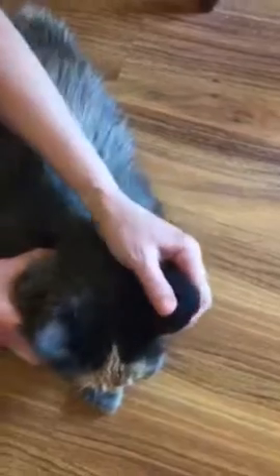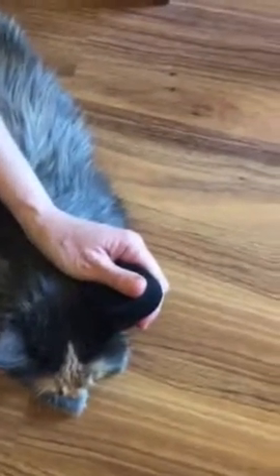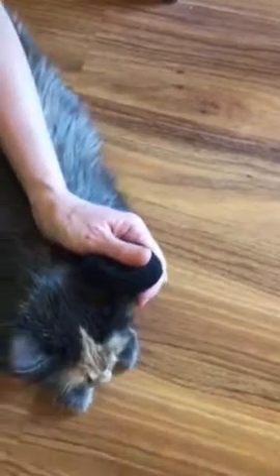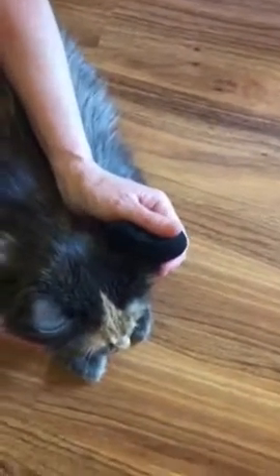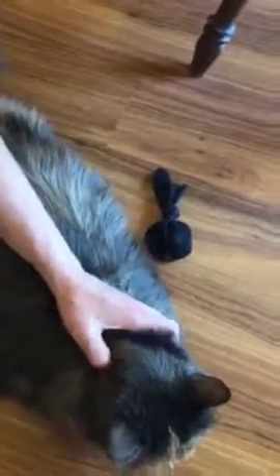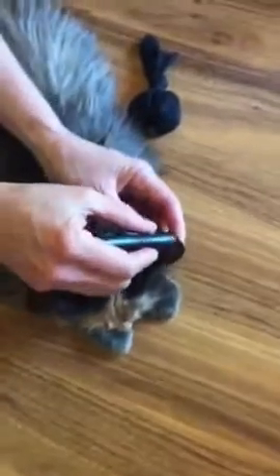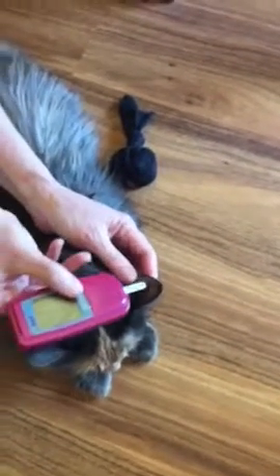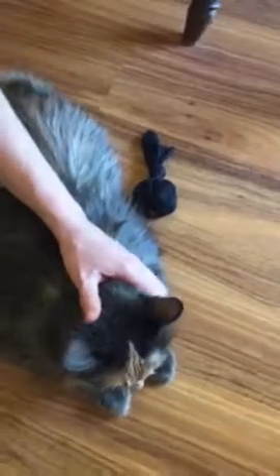I am going to try to hold the rice sock — it's a little bit cooler now — so I am going to warm her ear. Penny likes to be scratched under her chin. She wants to move, so I just did another football hold, but I'm not really restraining her. She hates when I warm her ear. This is her most unfavorite part — honey, you're being taped, can you please cooperate?